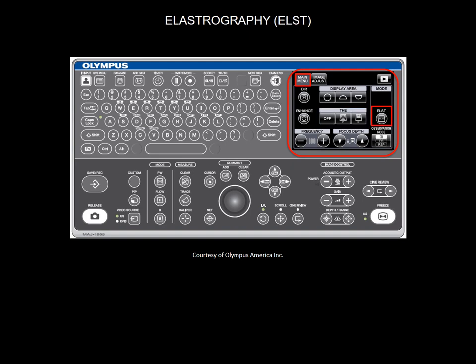Elastography key appears on the touch panel only on the Premier Plus processor. A new technology that assesses biomechanical characteristics. It displays the relative stiffness within the targeted area, by taking advantage of the deformation caused by the compression or vibrations generated by the heartbeat or vascular pulsations.